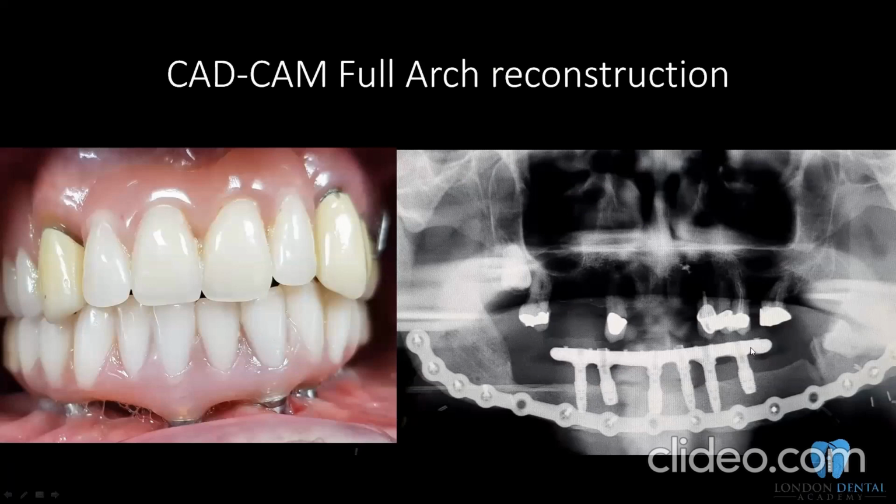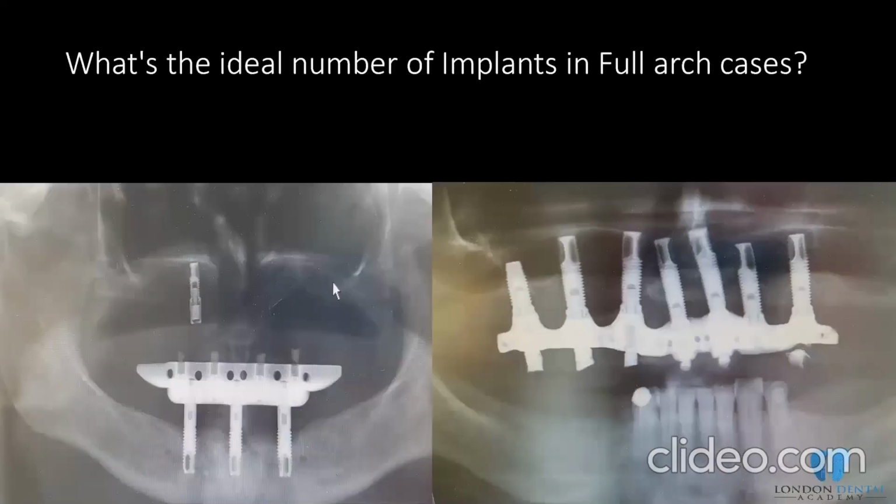reconstruction, I would say, the flaps being connected together at the top and the bottom. So it's quite a reconstruction, having this lateral type of splinting. So splinting the implants is always good for multiple implants.